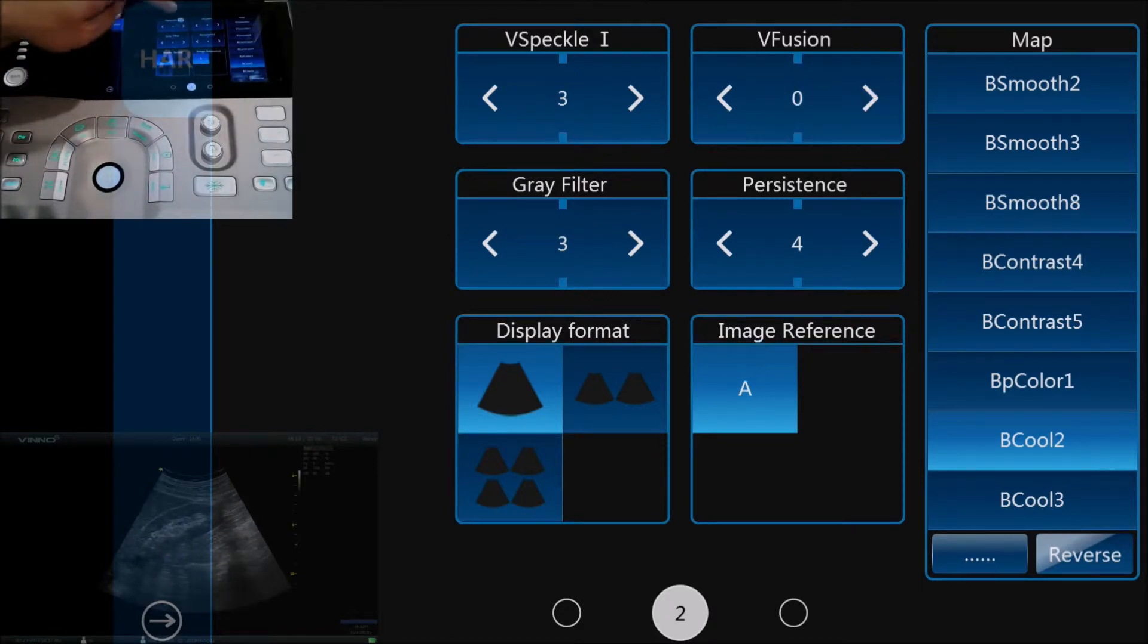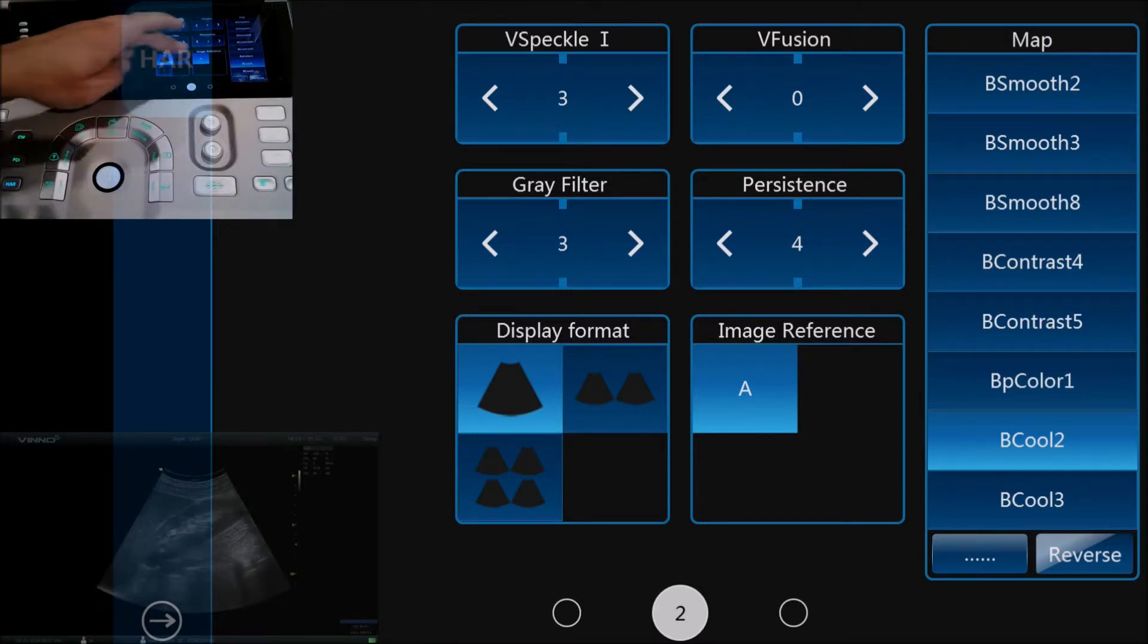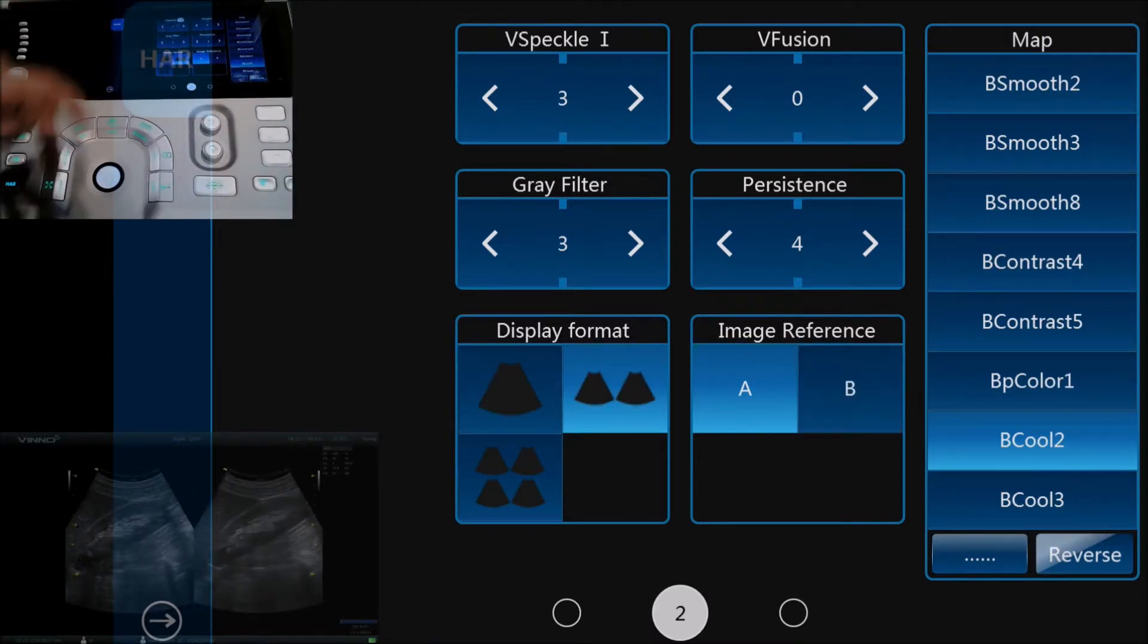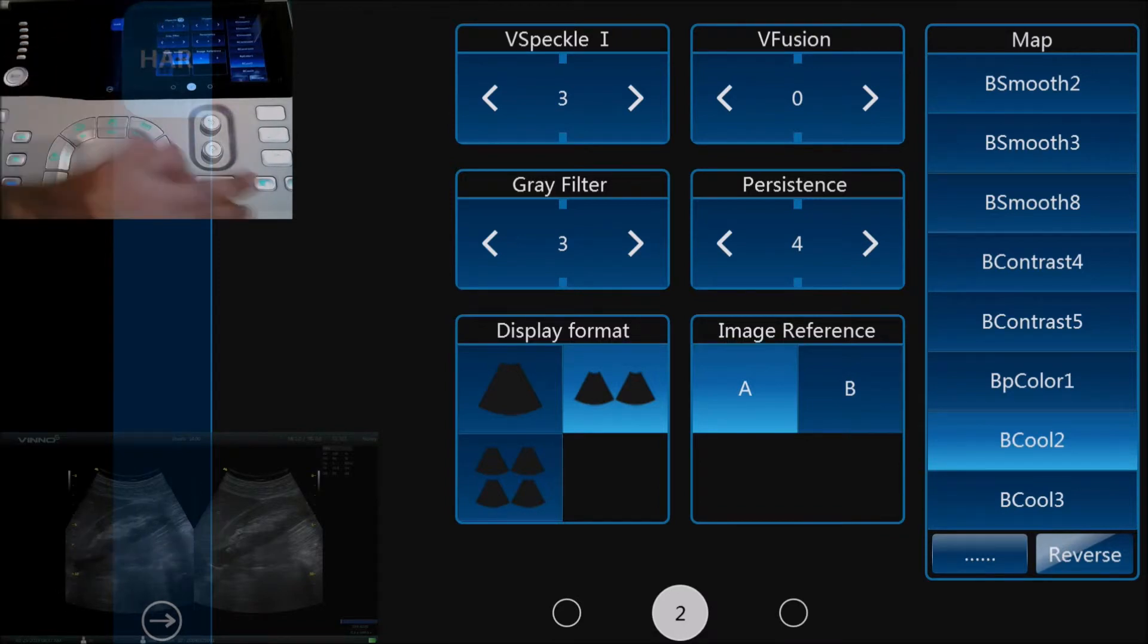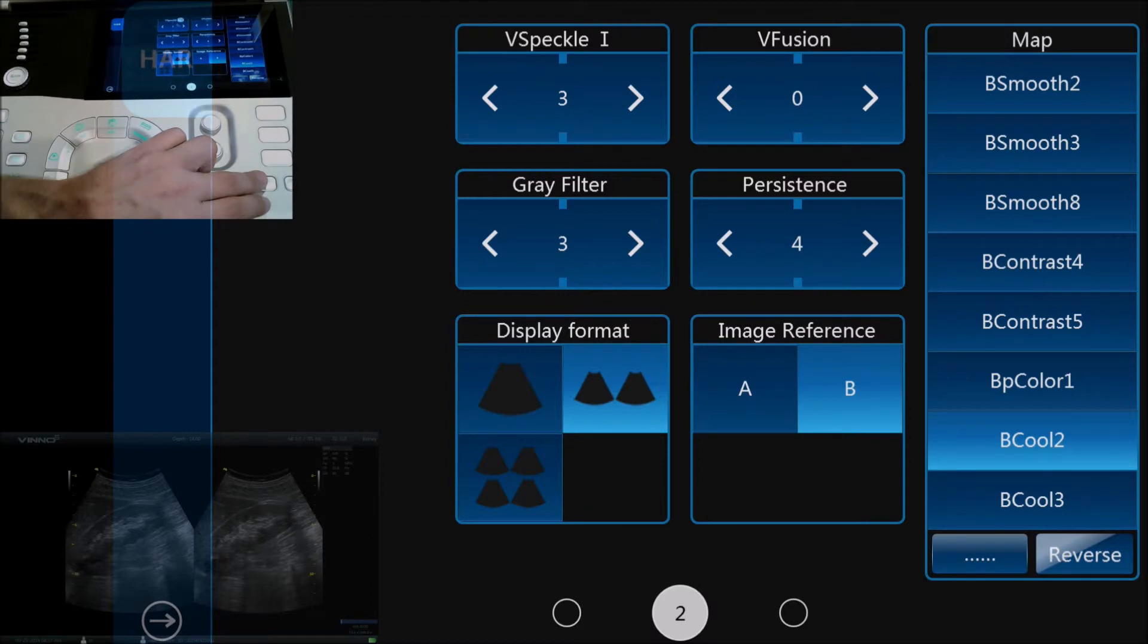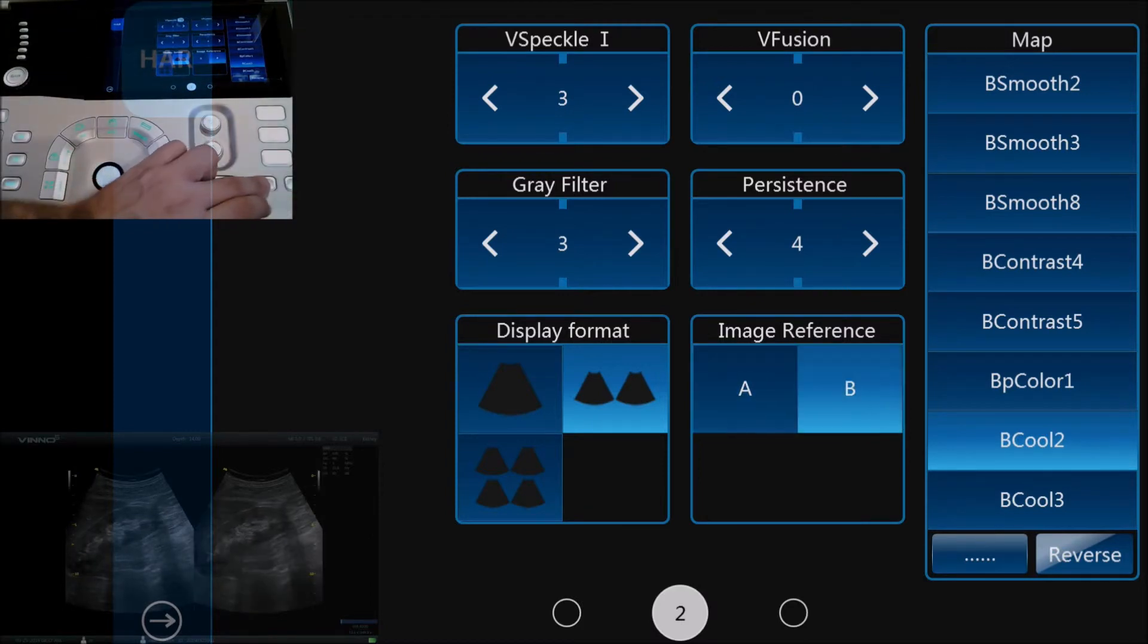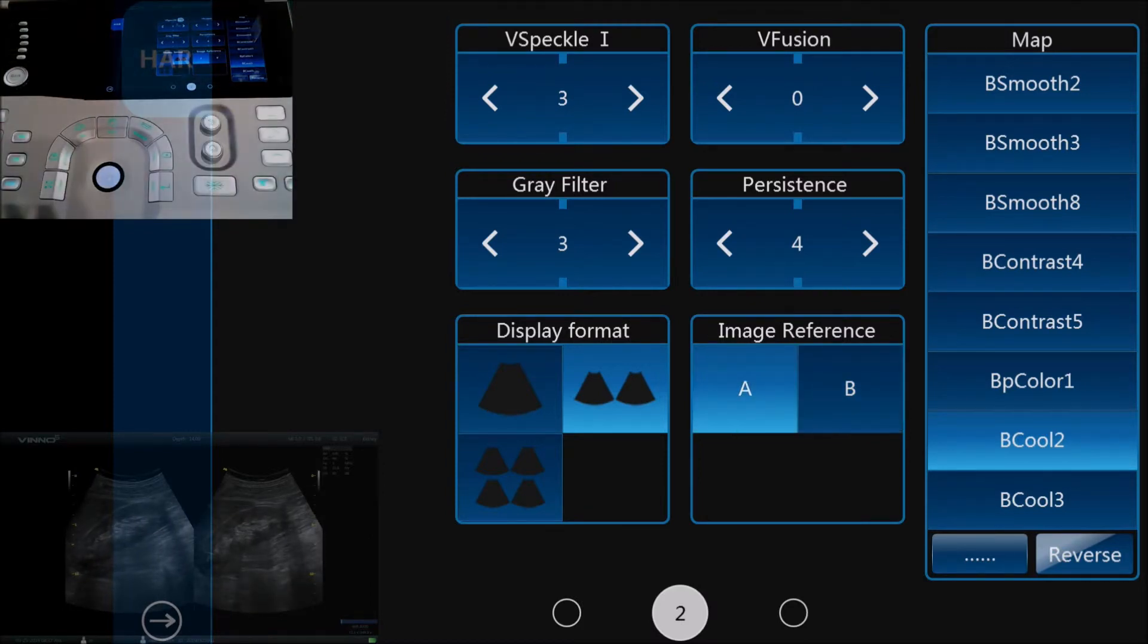If we want to do a split screen, we can change the display format here and we can toggle between the two screens using the key at the bottom of the image. To get back to normal imaging, we can just use the B button on the left bottom side of the screen.